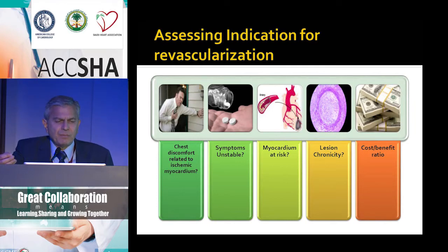Another thing to keep in mind is lesion chronicity. I'll give you an example. In my early days when I started performing angioplasties, a vivid example is one of a large dominant circumflex artery which had an osteal lesion and was very calcified, in a patient who's elderly and asymptomatic, who was referred just for a stress test and doesn't have any symptoms. So now we stumble on a 95% heavily calcified osteal circumflex, a large artery. There is a risk doing the procedure.